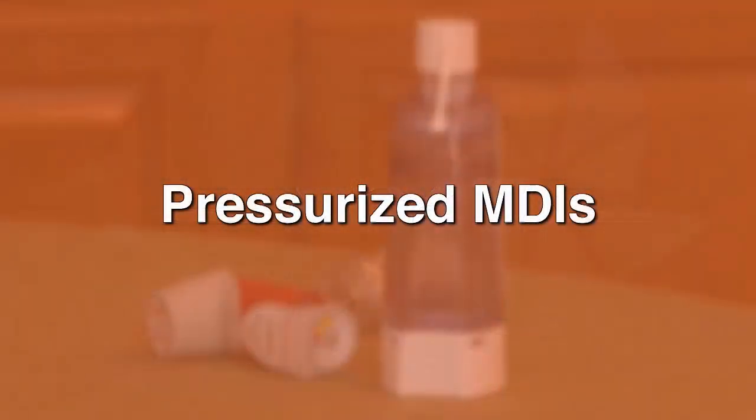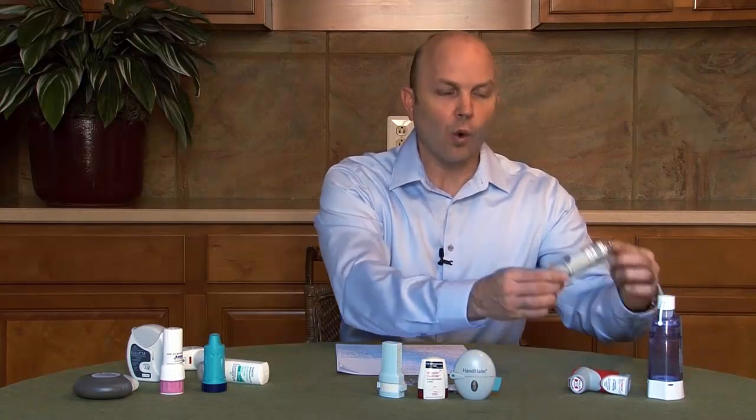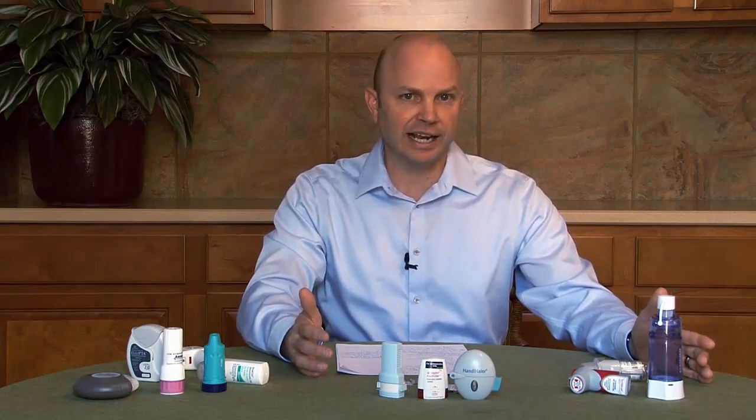Now let's focus on the pressurized MDIs. These come in 3 different variations. You'll either have a CFC inhaler, an HFA inhaler, or the soft mist inhaler. The CFC inhalers are actually no longer produced today. So if you still have a CFC inhaler, talk to your doctor and get it replaced.